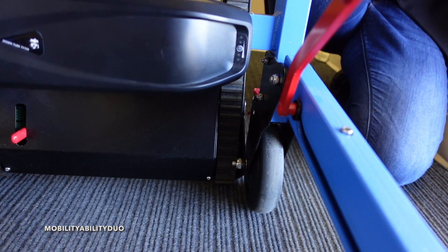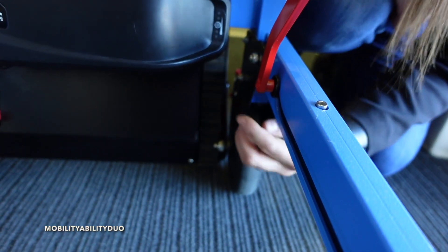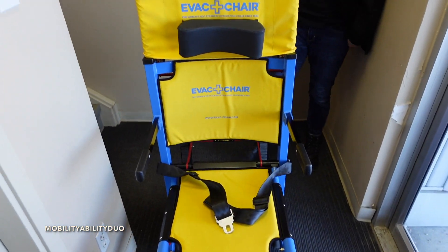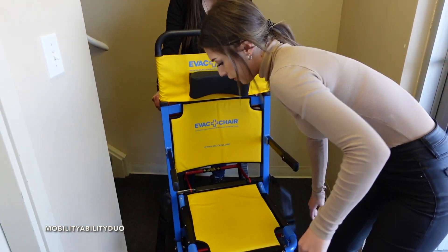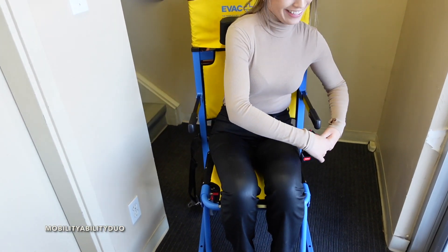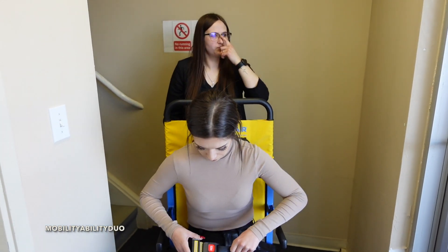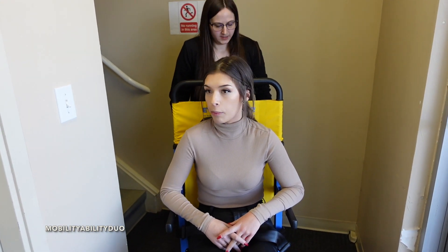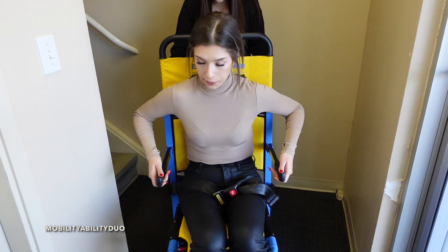Alright, let's get Kim in here. Kim says she signed a waiver before this. It's actually really comfortable - a bit different than the other one. The other one has more of an angle; this one's more of a 90 degree position, but once you go up the stairs you'll understand why. Kim says the armrests are really good, and she likes that underneath they have little grips for your fingers.